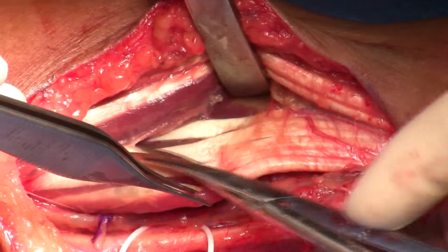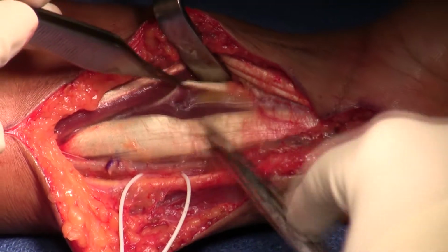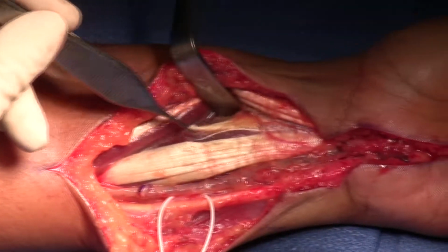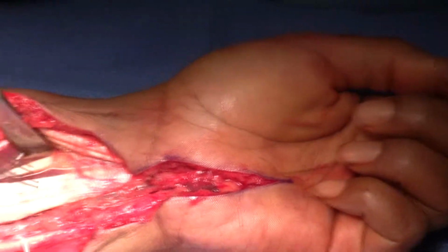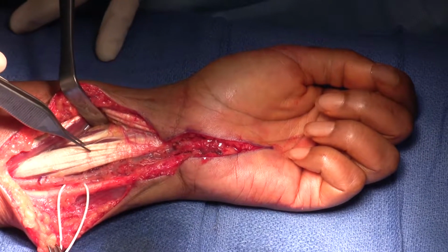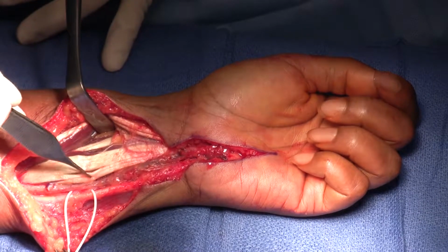So above the retractor are the superficialis tendons, and then we're going to identify the profundus tendons. Frequently the profundus tendon to the index finger will be independent, and if that's the case we don't include it in the tenodesis. We just let it be out there on its own. So now you've got the profundus tendons, and you just simply pull on the various components. Now that separate one is FDP to the index, so we're not going to include that. And then coming right over will be FDP to the long, which is working nicely in this patient. It's ring and small finger FDP that are denervated and don't work at all.